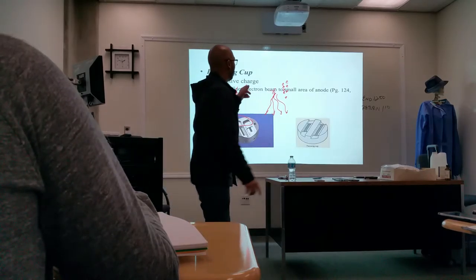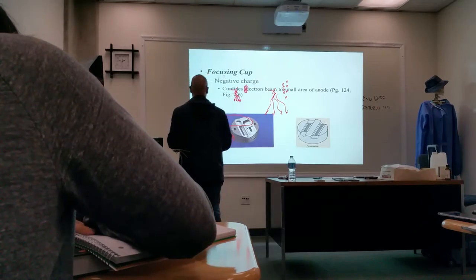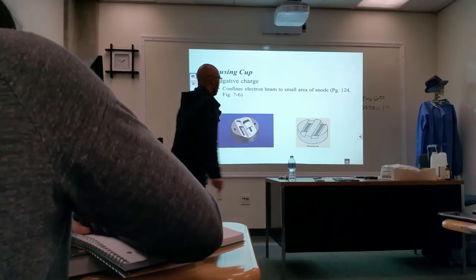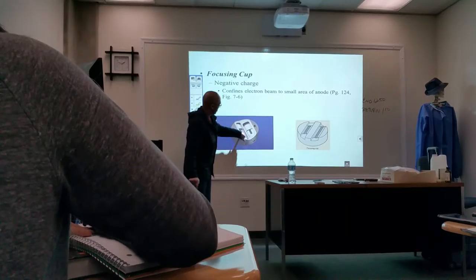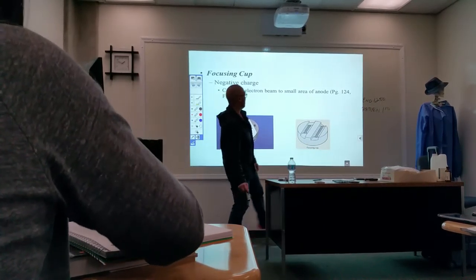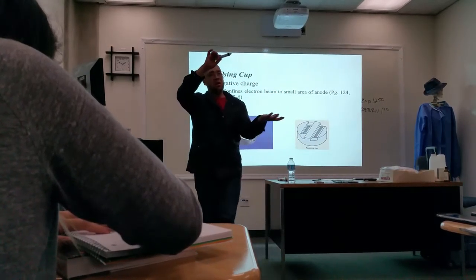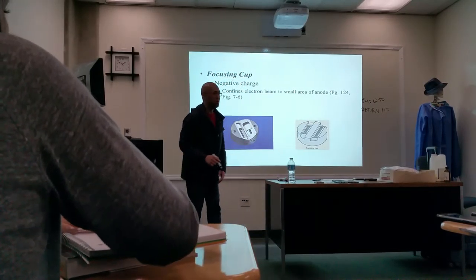All right, focusing cup. We're still at the cathode end. You have your cathode, you have your two filaments. You have a small and you have a large. Encompassing that area, okay, is what's known as a focusing cup.